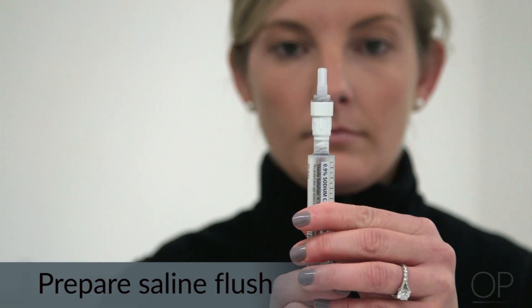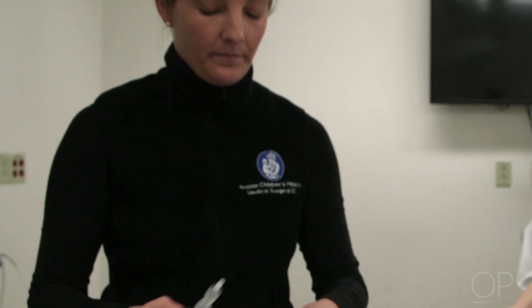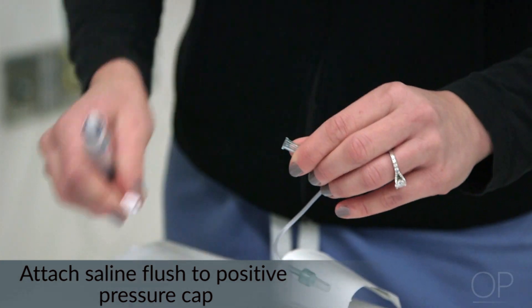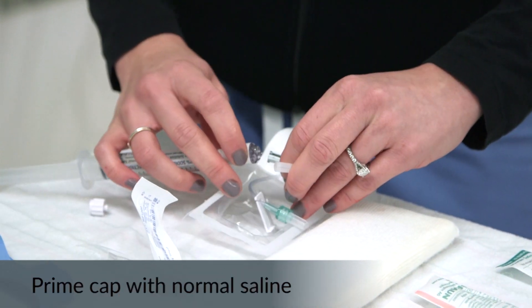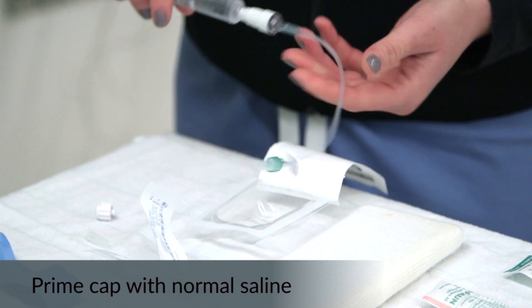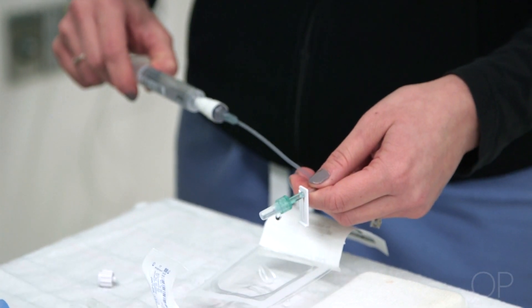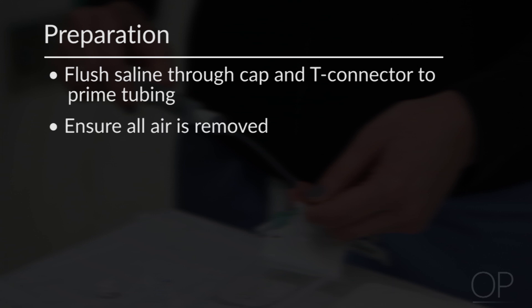Open the T-connector and prepare your saline flush. If available, open the positive pressure cap. Attach the normal saline flush to the cap and prime it through with normal saline. This cap provides a safety feature that prevents backflow of blood from the vein or air entry into the vein when the extension tubing or T-connector is not clamped. Flush through the cap and the T-connector to prime the tubing, ensuring all air is removed.